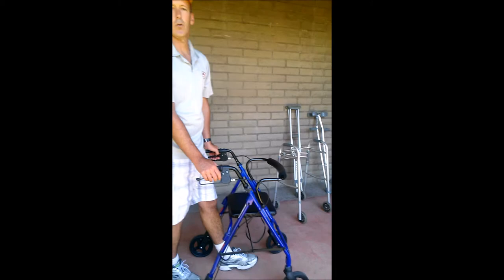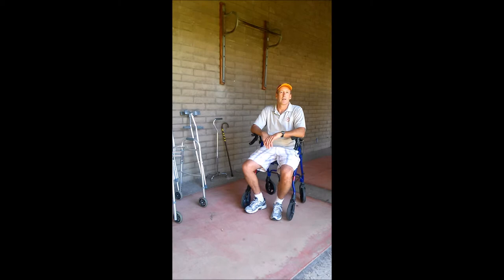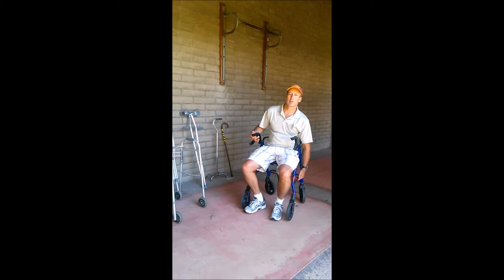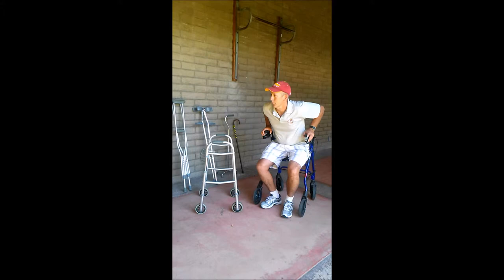The four-wheel walker has wheels that pivot, allowing you to turn, put on the brake, and have a seat. A lot of them have baskets below where you can carry your oxygen tank or groceries. This is the Cadillac; as we move down the list it becomes the Toyota Corolla.